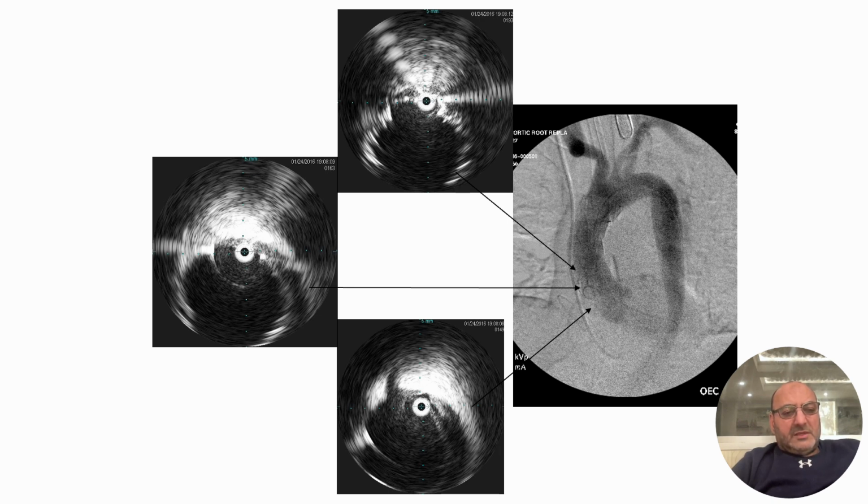You have to have a team in place, and the team consists of a cardiac anesthesiologist, a cardiac surgeon, and a vascular or endovascular operator who has experience doing TEVARs and things like that. You have to have skilled technicians. You have to have appropriate imaging studies, IVUS, TEE. You have to have the right people, and you have to have a cardiologist as well. Everybody has to work as a team here, and only this way can you have successful results with this.